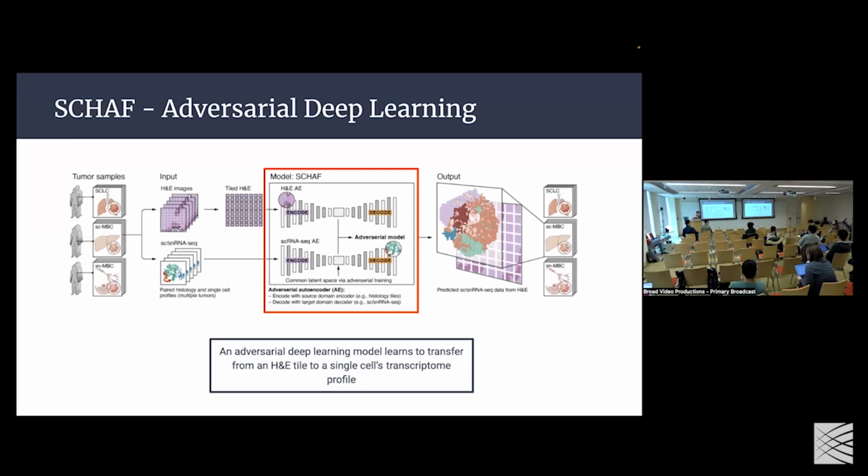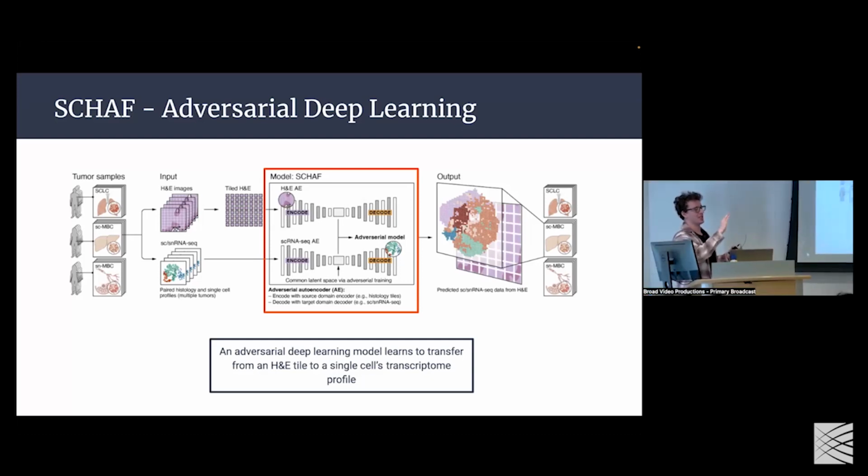Yes. When you're doing the tiling, are you purposely making sure that there's one cell in each tile, or is it just a random one? Excellent question. In order to set up the stage for future work, because it would be great if we segmented the cell and did all this stuff to make it better, we wouldn't be able to do that if we just did that initially. I'm just kidding. But the cool thing is we just ran the first experiment, just sliding a tile, not really thinking about segmenting or anything like that. And the results were actually pretty nice. So we said, oh, this is cool, we should keep doing this. With that being said, in this iteration of the work, we do not do that.